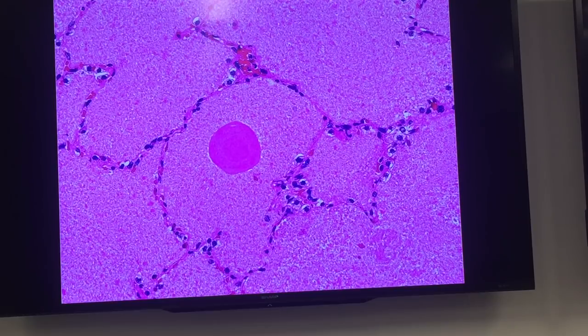Anything else? What is this big old Goomba in the center? Artifact? Concretion. Okay, something pink, right? Pink and acellular. How about the interstitial? Is it super abnormal? A little bit abnormal? Inflammation. Huh? Where? Where is the inflammatory cell? Like that? Man, you're really stretching it, Ellie. But okay, I'll give you maybe, but I don't see anything at all. I do see cells, but there are cells in the interstitial, right? There's pneumocytes. There's capillary endothelial cells, so maybe it's one of those.